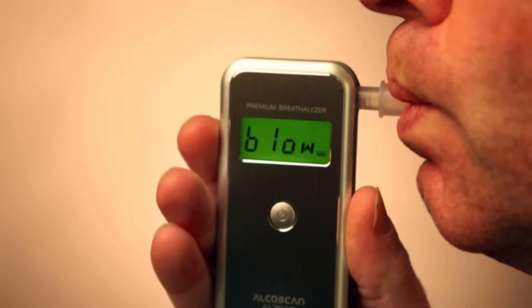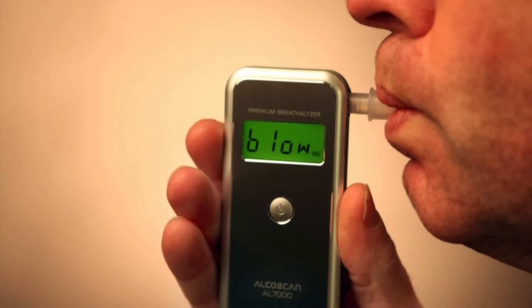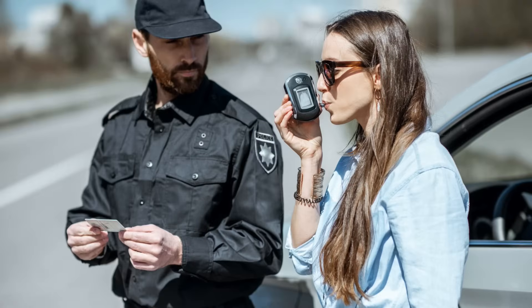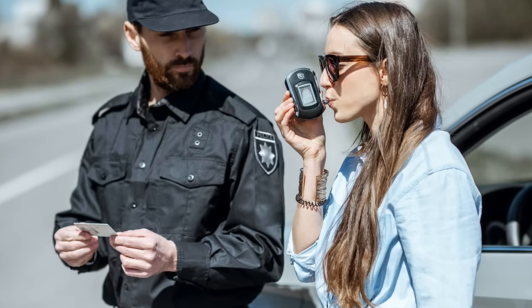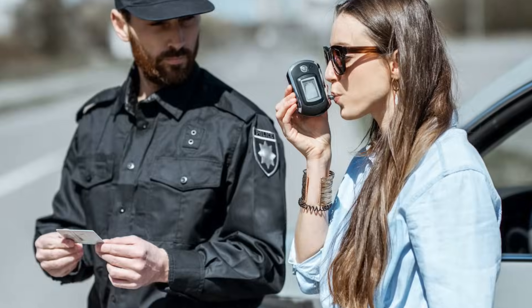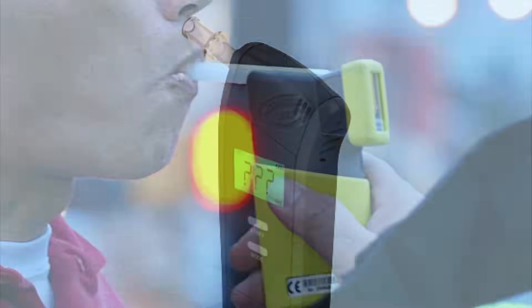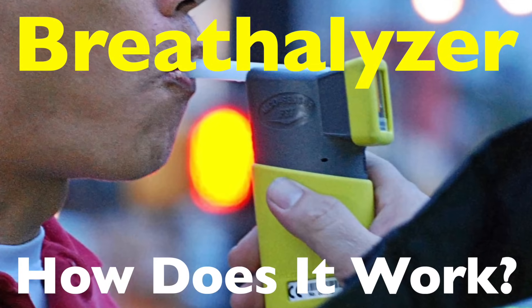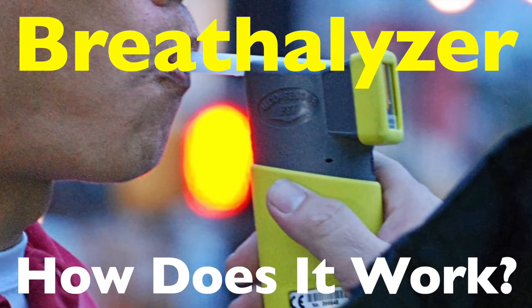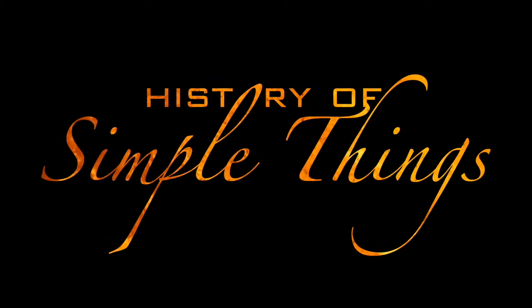Have you ever wondered how a tiny device can tell how much alcohol is in your system just by analyzing your breath? It almost seems like magic, but it's actually science and a pretty fascinating one at that. Breathalyzers have been around for decades, helping law enforcement, workplaces, and even individuals monitor blood alcohol content with just a puff of air. Let's break it down right here on History of Simple Things.